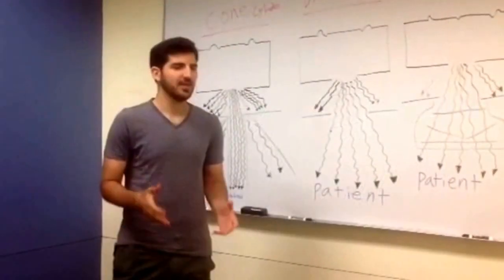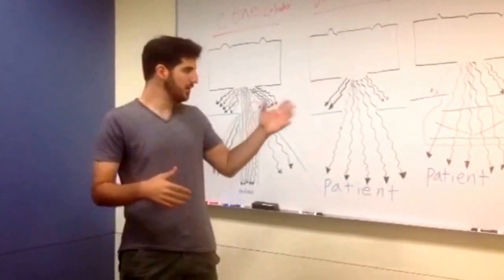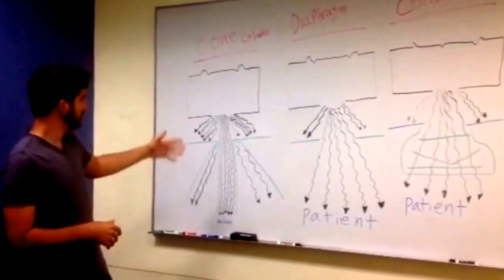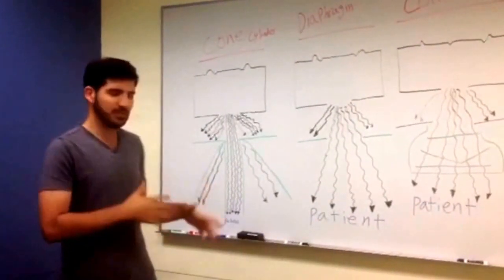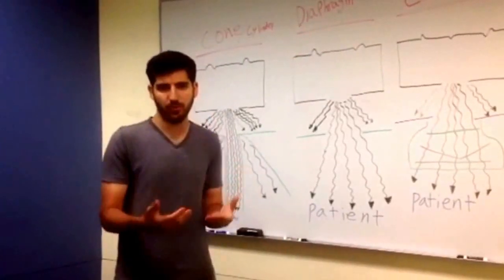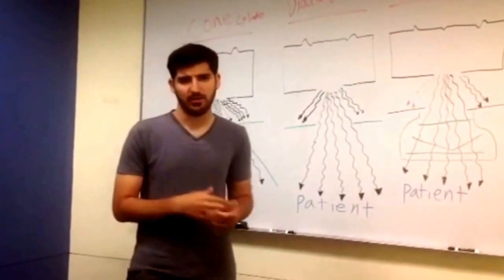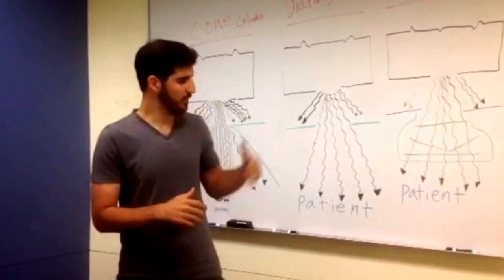You realize that there are certain limiting factors or limitations that each one of these devices have, such as the coned image that is produced with the cone beam restricting device, and there are several other factors that we hope could be improved in the X-ray field as there are more advances in technology and more scientific discoveries that we hope to have in the future in the X-ray field.